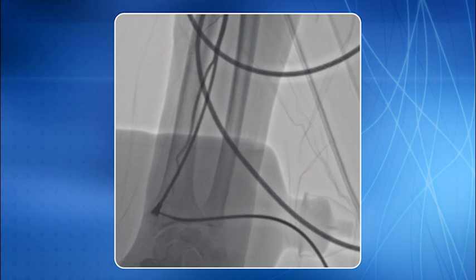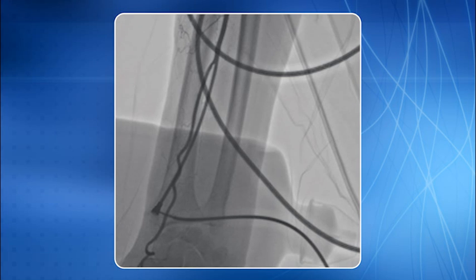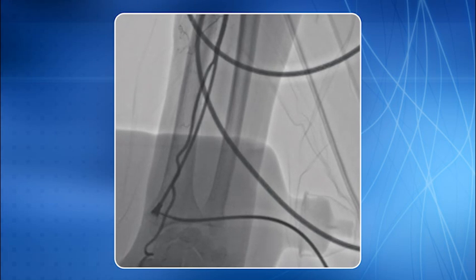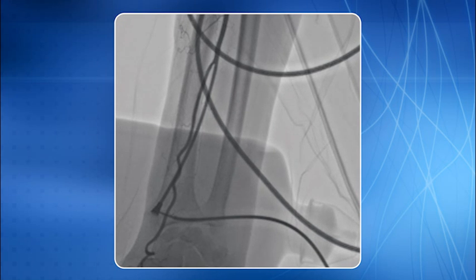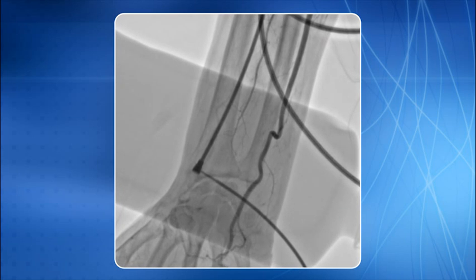We then palpated and punctured the radial artery in higher segment, and injection through the side port of the introducer sheath revealed that it was a separate intermediate artery and there was a small radial artery passing beyond it which also showed a loop in a very low region. A long cine angiogram demonstrated both low radial as well as ulnar loops. This is an extremely rare anomaly.